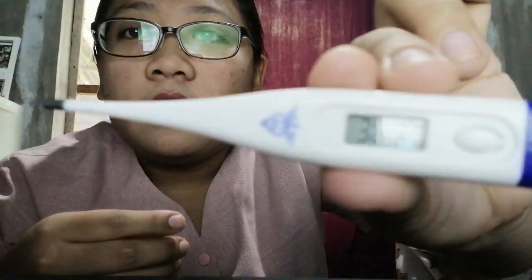The thermometer has beeped. His temperature is 36.9 degrees, and it is normal. I removed the thermometer carefully and read the temperature on the digital display.